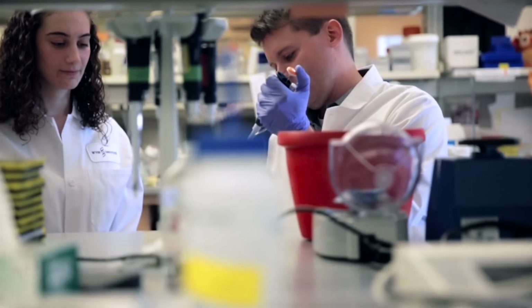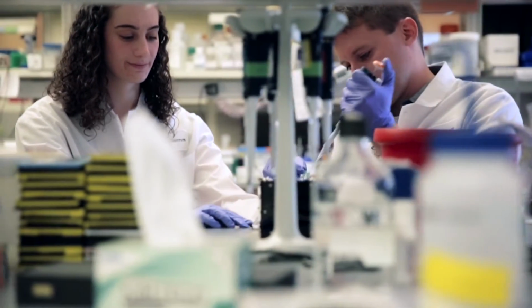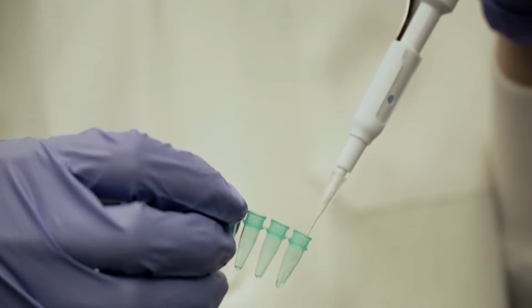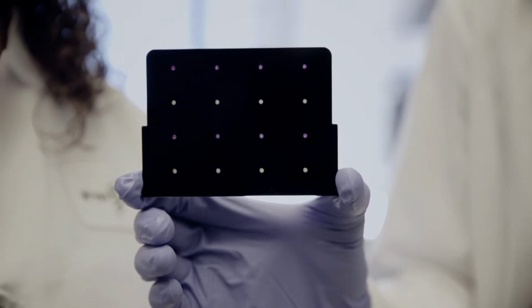First of all, you start with a patient sample, and then you amplify it. That creates many copies of a small part of the Zika genome. The concentration of the virus in the blood is very low. By doing an amplification step where you try to just increase the number of RNA molecules, it now makes it easier to actually detect the presence of such RNA and get a measurable readout where you could, for example, in our paper-based scheme, see a change in color.